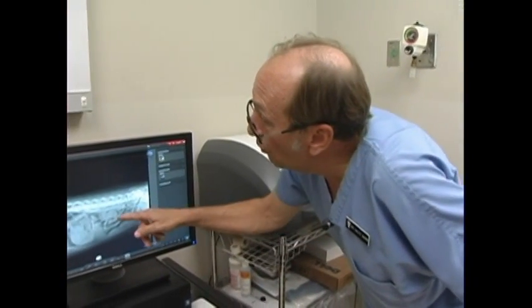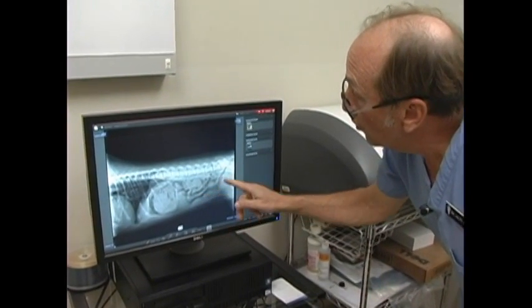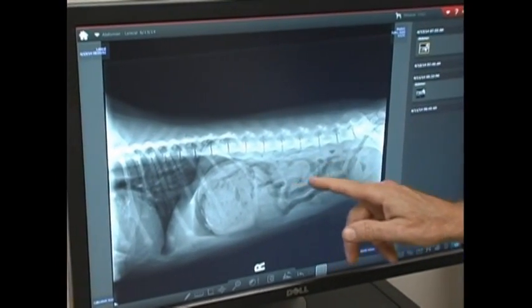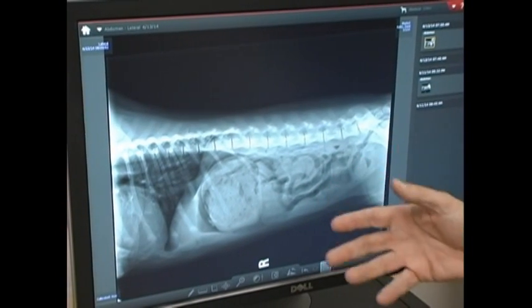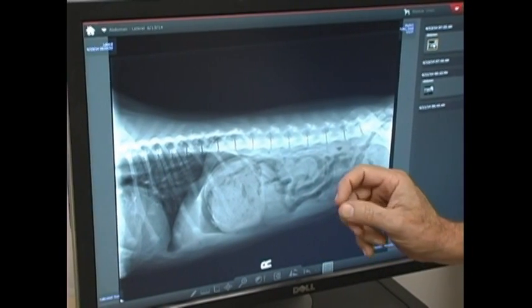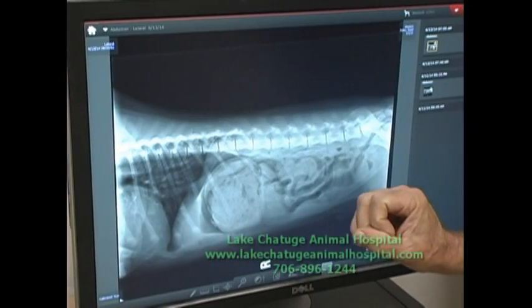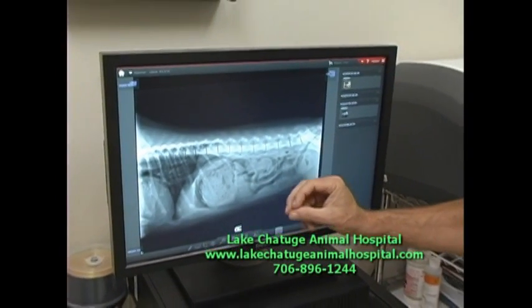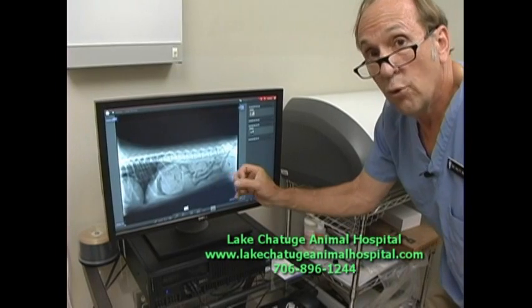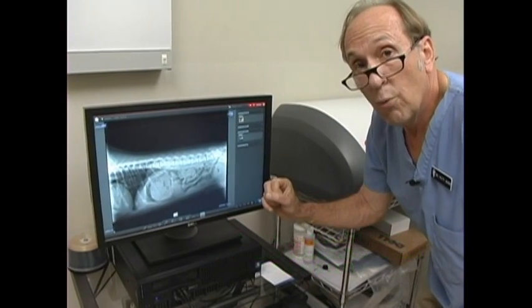Okay, now here's Isabel's lateral view. For sake of time, I'm just going to focus on this because it shows what I want to show. This is actually normal ileus, we call it, gas in the intestinal tract. That's actually the colon right here. And the small intestine is this area right in here. Because she is having a GI event, she does have a lot of gas buildup. But the main problem with Isabel is that she has a distended stomach, and although I don't see any foreign bodies, which is great, based on this radiographic film, it looks like we're dealing with a gastritis, an inflammatory process of the stomach. Should be a pretty easy, straightforward treatment, but we will obviously have to monitor very closely and make sure she responds. But I believe she'll be just fine with appropriate treatment.